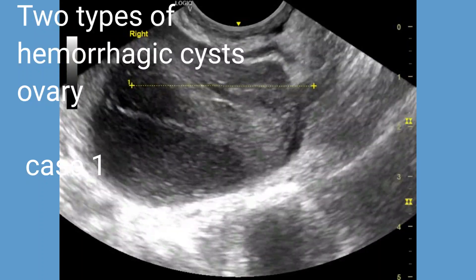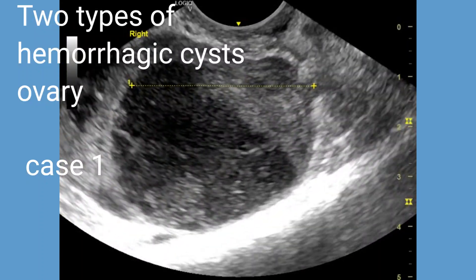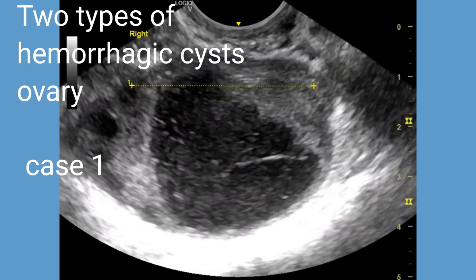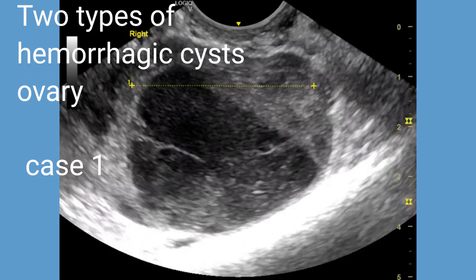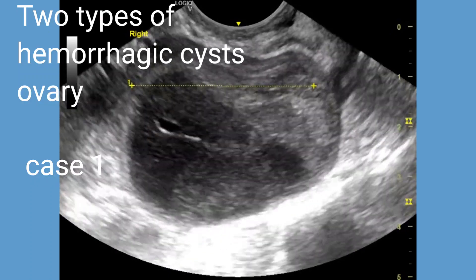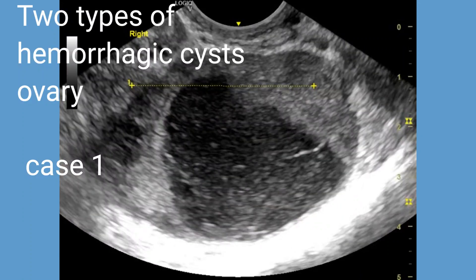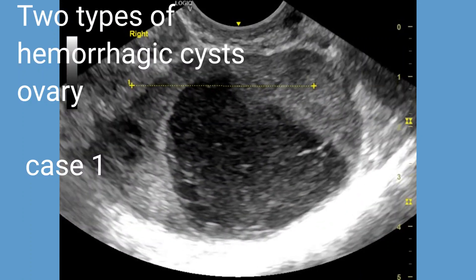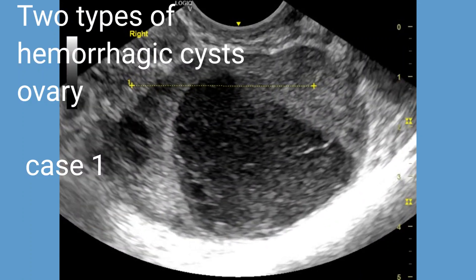Fluid debris levels and the fishnet appearance are two different ultrasound findings that can be associated with hemorrhagic ovarian cysts. First, we describe the fluid debris levels seen in hemorrhagic ovarian cysts.